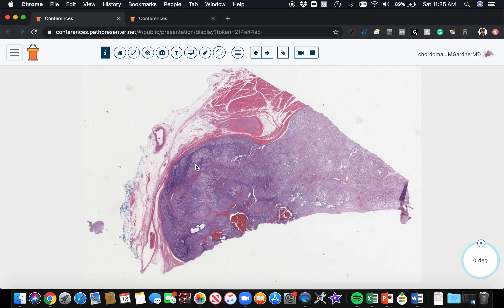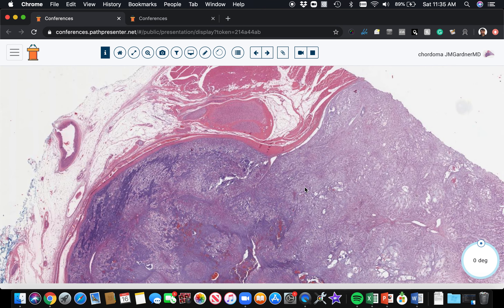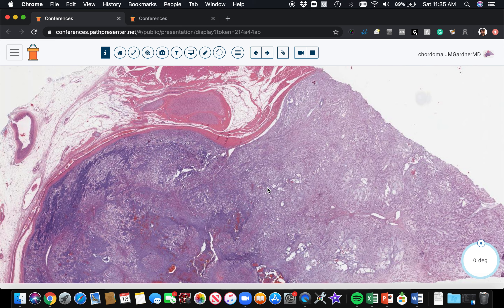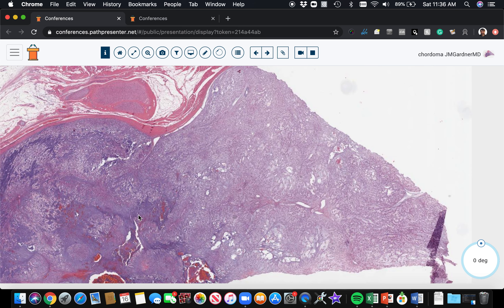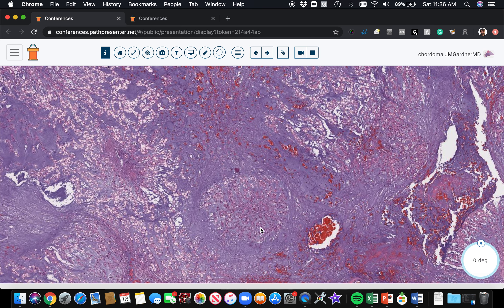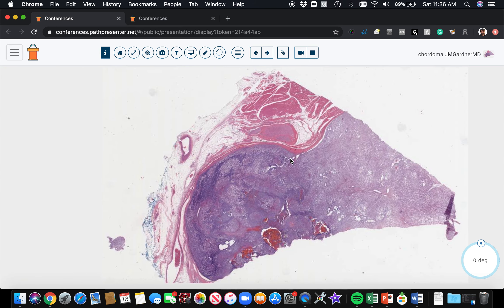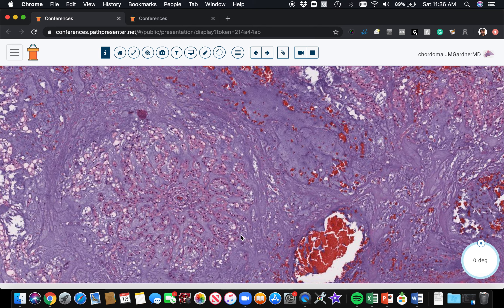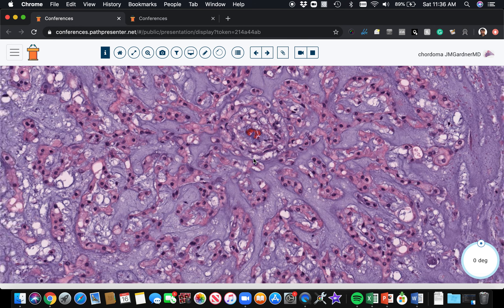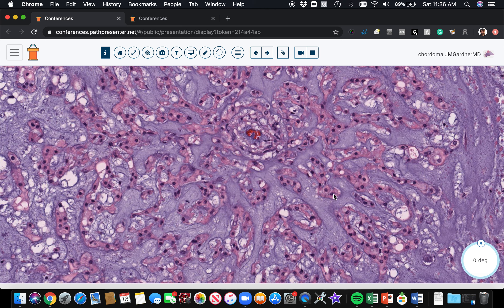Next case — this is a nice example of chordoma. Chordomas are tumors that most commonly present in and around bone at either end of the spine: at the top where it joins the cranium at the clivus, or at the inferior end at the sacrum. Very rarely they can occur in bone and soft tissue outside of those areas. Here is the classic appearance: a tumor that is usually multinodular and multilobulated, with a very abundant blue myxoid background. In that myxoid background you have cords and chains of epithelioid cells making little nests, islands, and cords throughout this myxoid background.